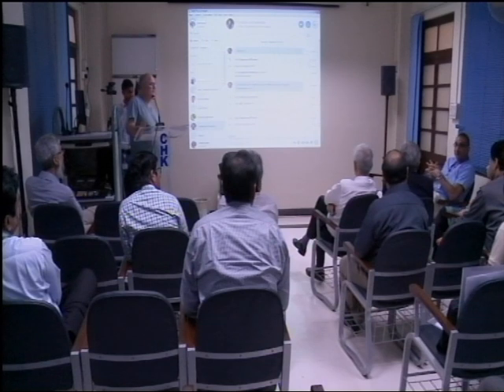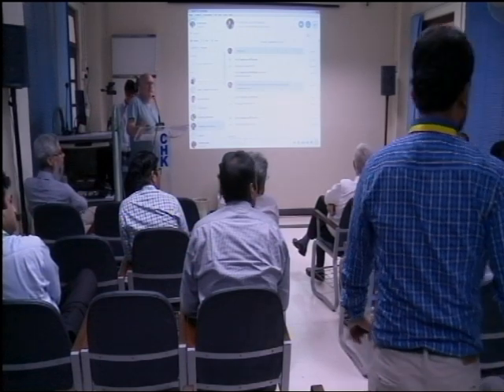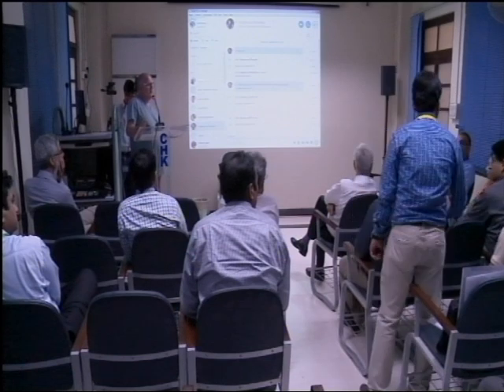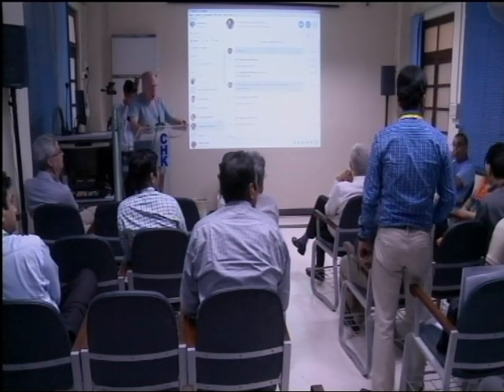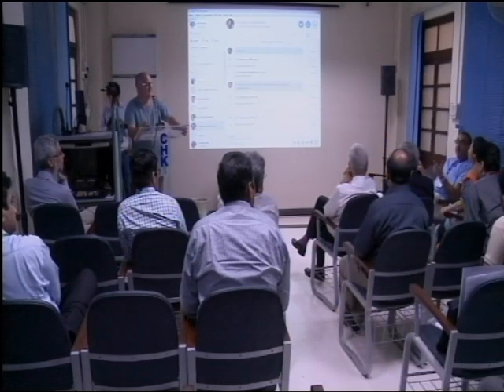Why do you have the surgeon stand by with you? What difference does it make if he is with you? Standby. It doesn't have to be in the department. But normally what we do is, yes, he should know that I'm doing something serious and he should be available.